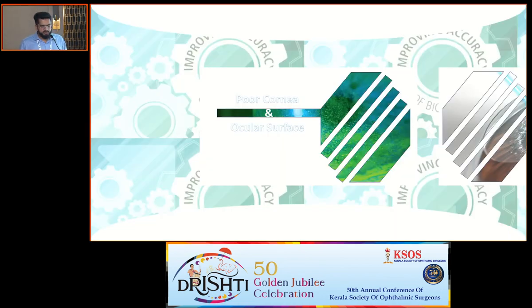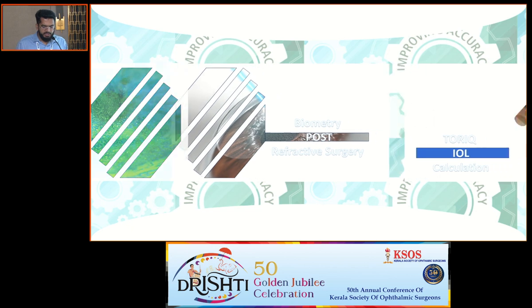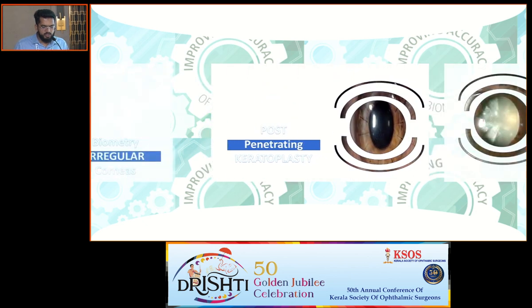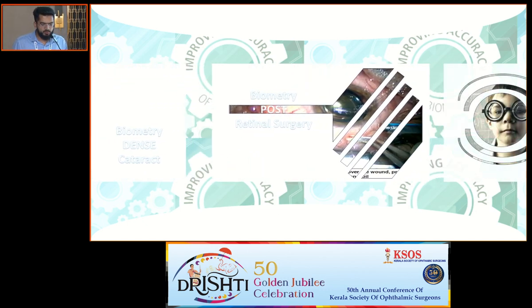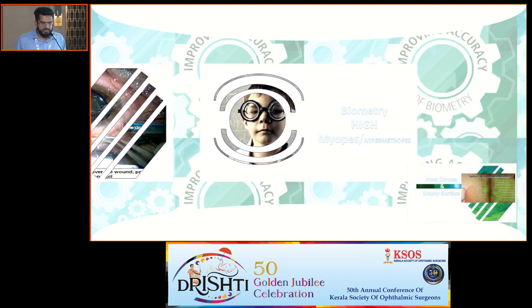So the few difficult situations I have kept in mind are when you have a poor corneal or ocular surface, when you have to do biometry post-refractive surgery, the detail of which would be given by Dr. Chitra Madam. And when you have a toric IOL calculation, when you have biometry in irregular corneas, when you have to do biometry in post-penetrating keratoplasty, when you have to do biometry in dense cataracts, when you have to do biometry post-retinal surgeries, and of course biometry in high myopes and hypermetropes.